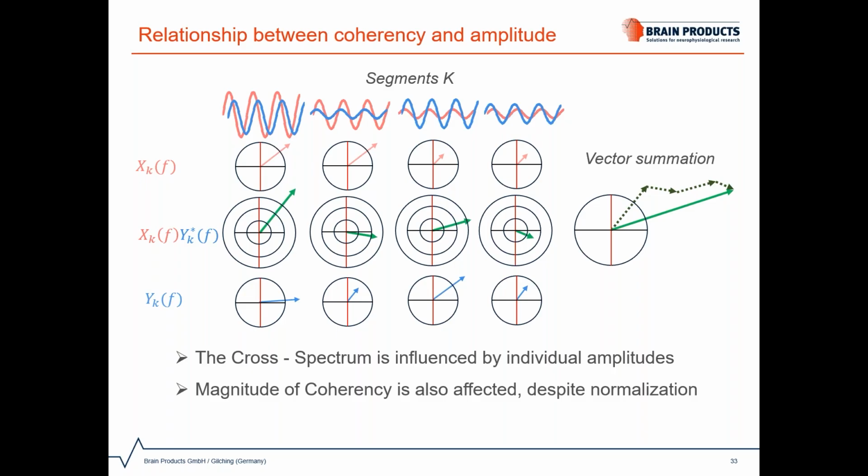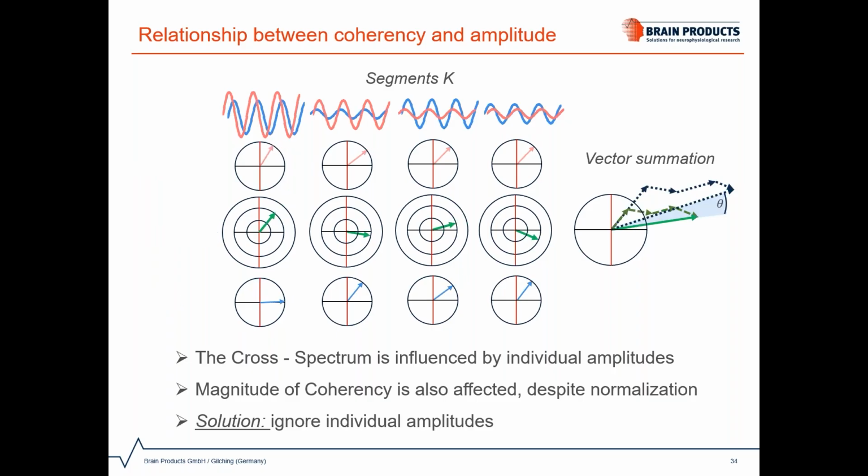This dependency is in particular problematic when the research question requires to quantify phase synchrony, but also if you compare conditions where the overall power of the involved oscillations varies. In this case, the contribution of the connectivity that is amplitude related or related to the phase differences are not clear, and a more strict phase synchronization method is needed. In order to meet these difficulties, measures have evolved that ignore the amplitude.